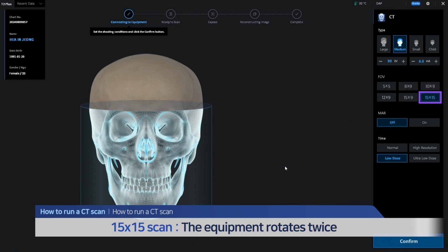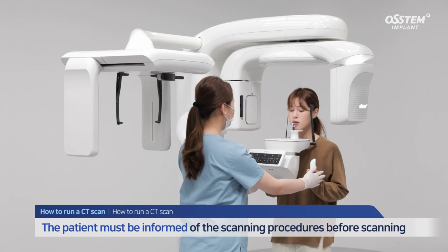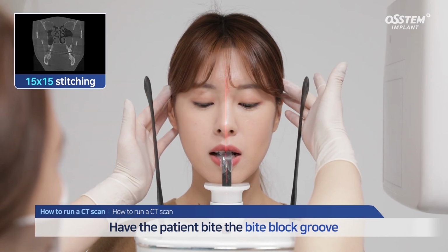For the 15 by 15 scanning, the equipment rotates twice. Since the equipment rotates twice and the position of the handle moves, the patient will need to hear an explanation before scanning. Have the patient rest their chin and bite the bite block groove.